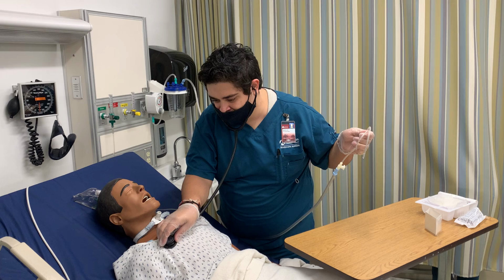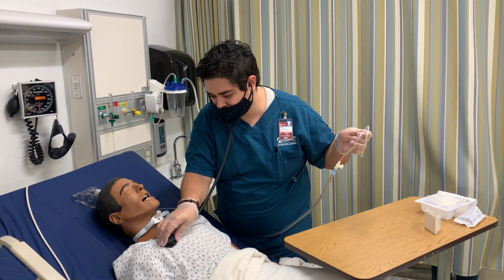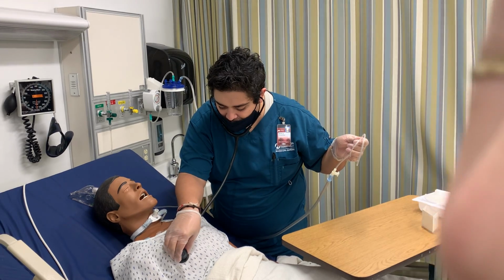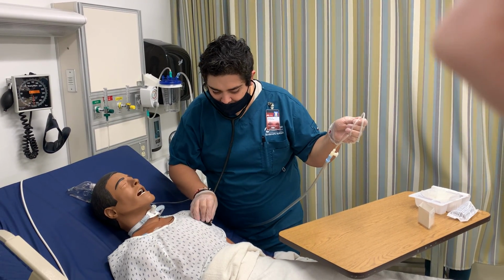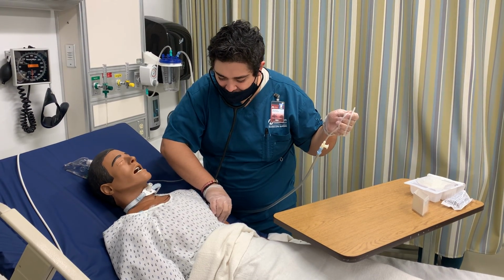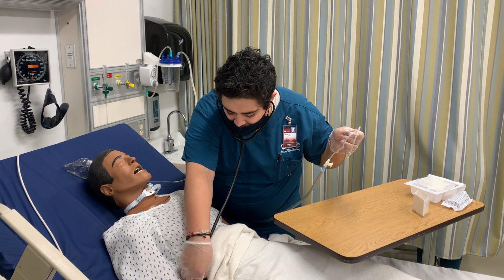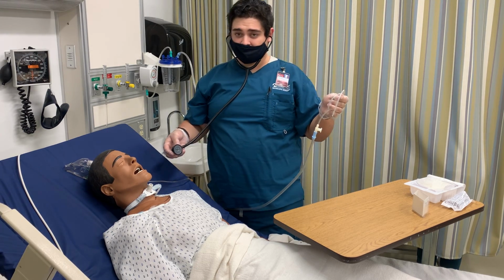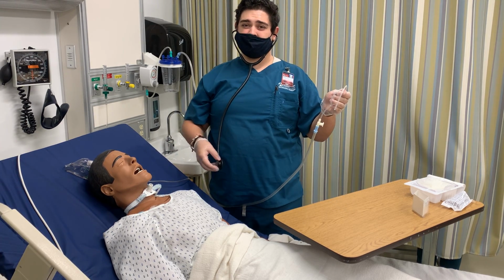So can you give me deep breaths again? Deep breath. Deep breath. Deep breath. Okay. I will also do this for the posterior side.